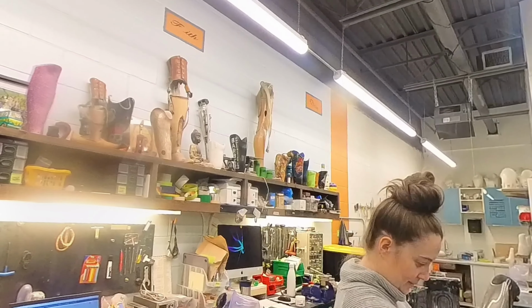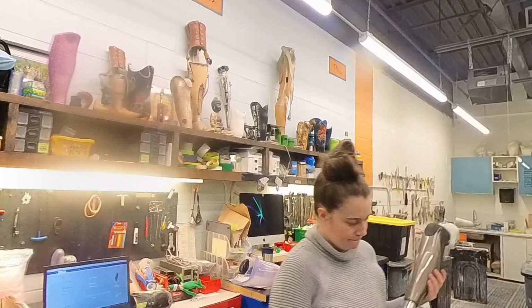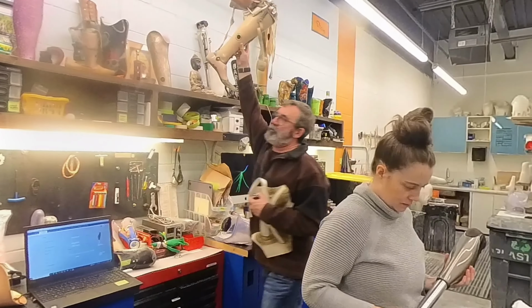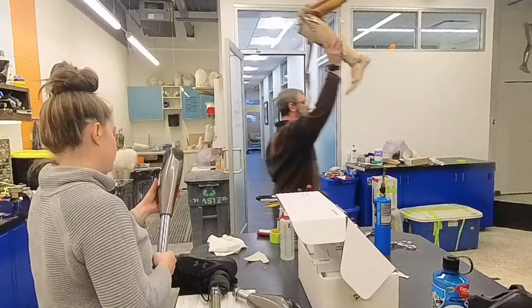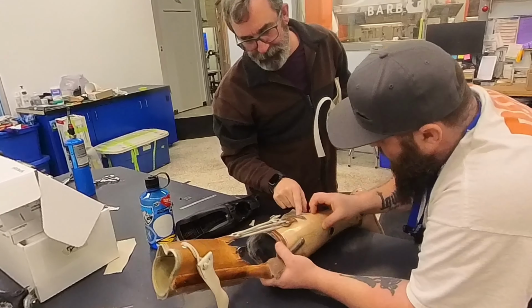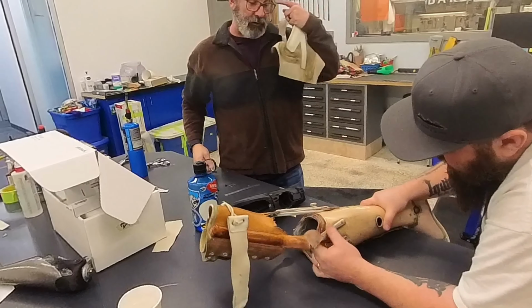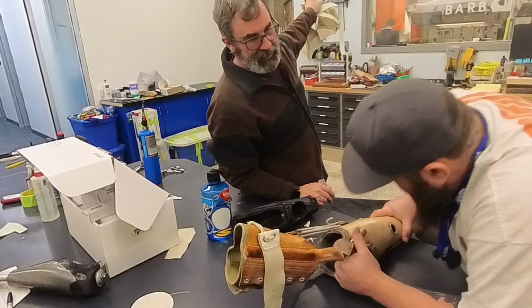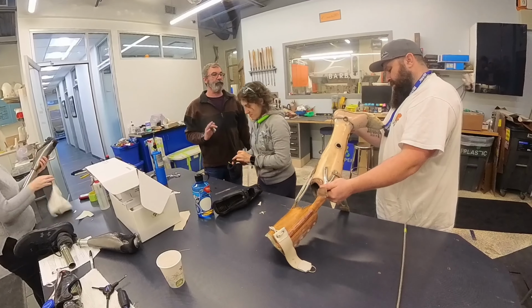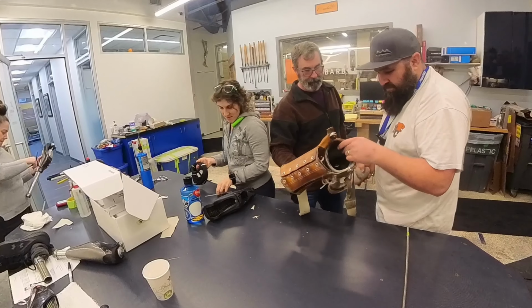So one right there is metal too, the short one with the leather on top. This one here. Did you build that? Oh, look. This is 53. Dude, I wasn't even on the earth. Holy cow. So you gotta understand where the technology of that leg is. How heavy is that thing? A different animal now. It's wooden, still, with a foot. All metal.